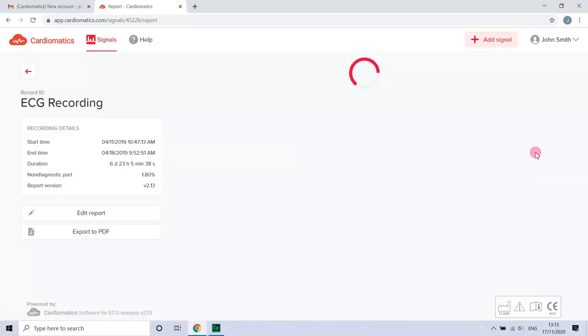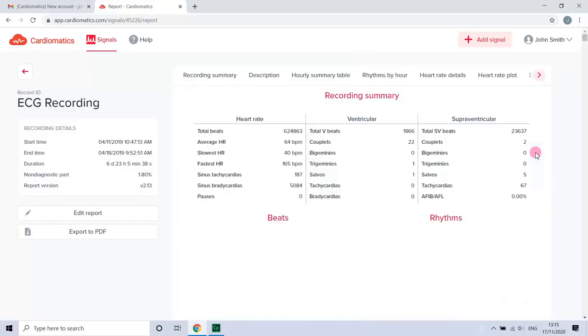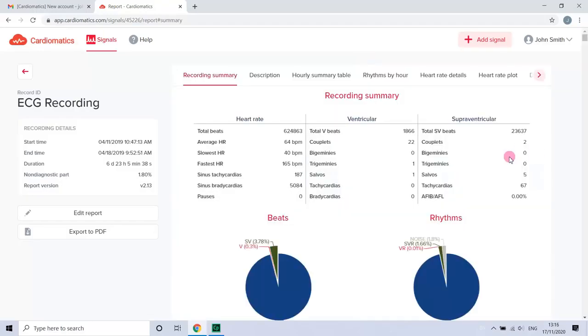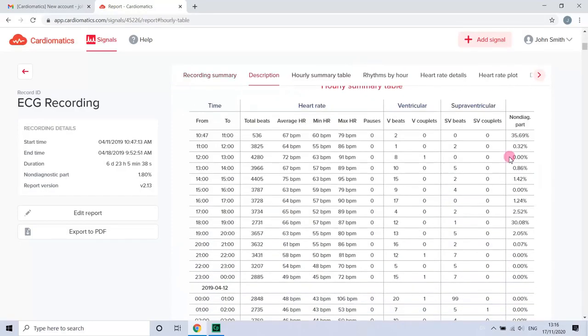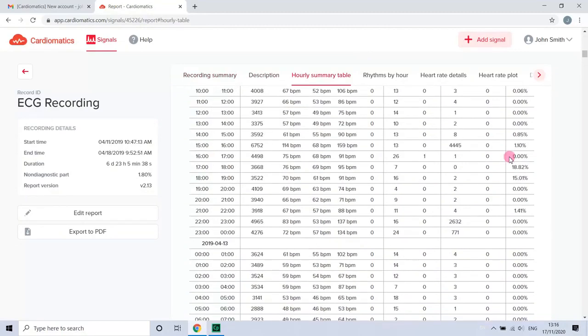When the process is finished, you can view your report. You can check its individual sections.